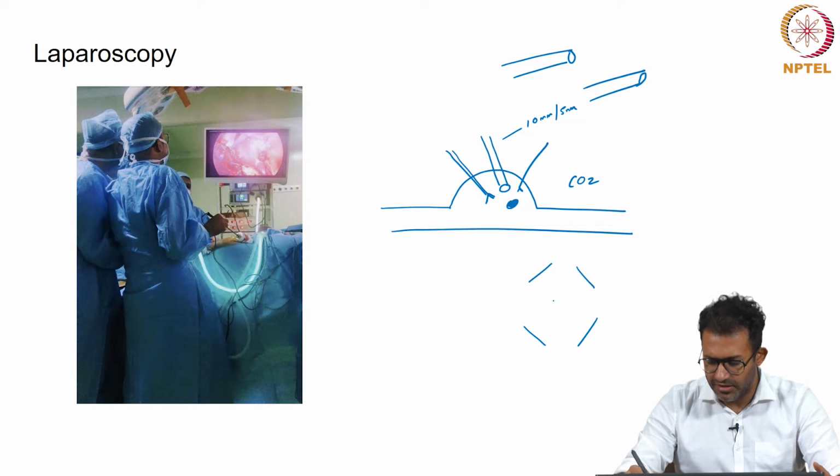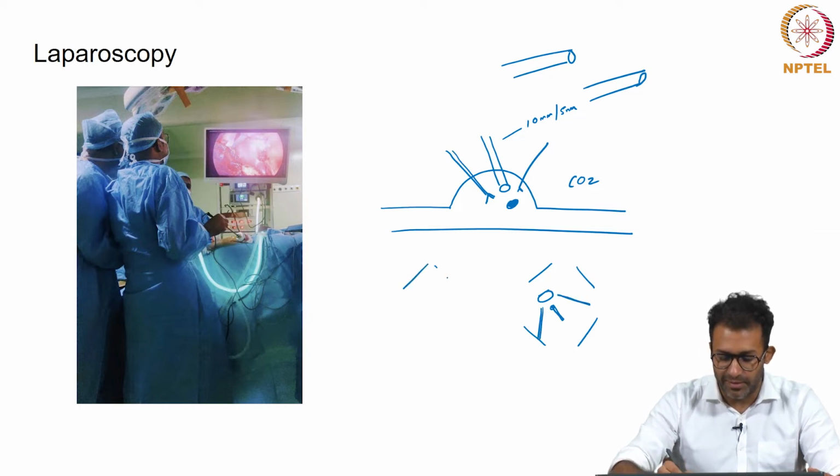So this is the abdomen. I am just going to take the example of a gallbladder. So here is your gallbladder. While approaching an organ, what you essentially follow is the principle of triangulation. If this is the gallbladder and you need to approach it, your camera should be angled in this manner in the center, and your working instruments should be like this. This is called the baseball diamond configuration, where you approach the target organ like a baseball diamond. The instruments are here and the camera port is through here.